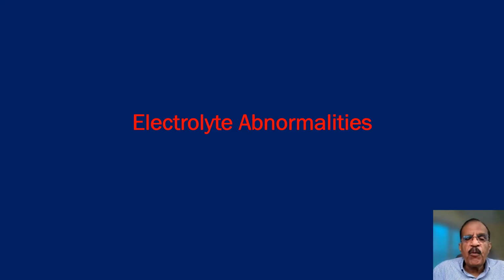If you have a proper clinical setup, then the ECG may show classical changes, and they are very fast, and the moment you do an ECG, you have the report with you and you can suspect some electrolyte abnormality. But the gold standard of these electrolyte abnormalities remains actual electrolyte testing.